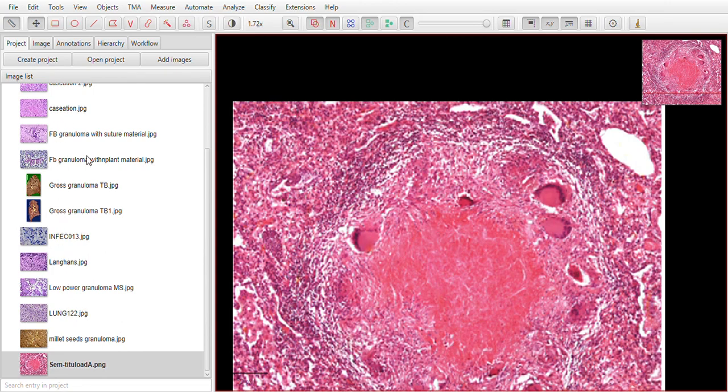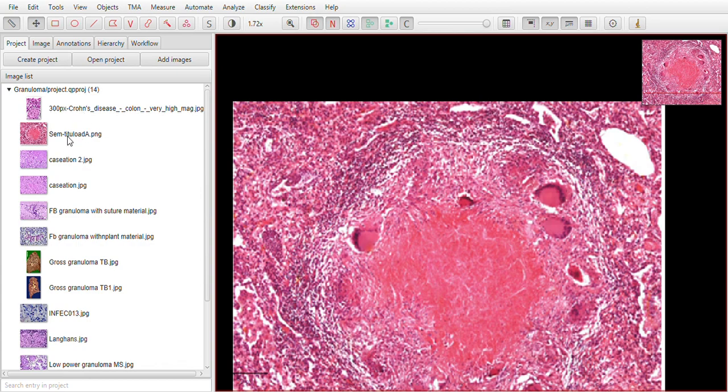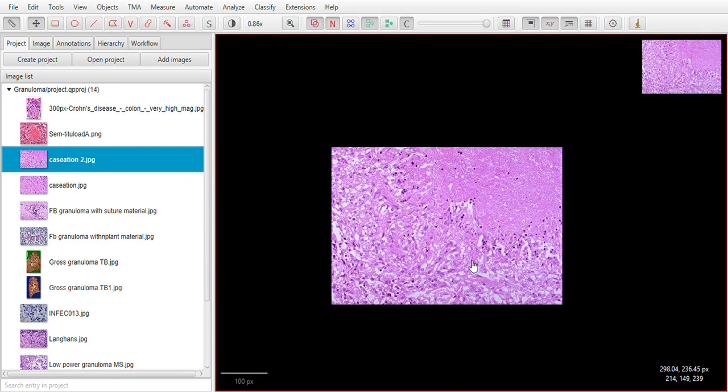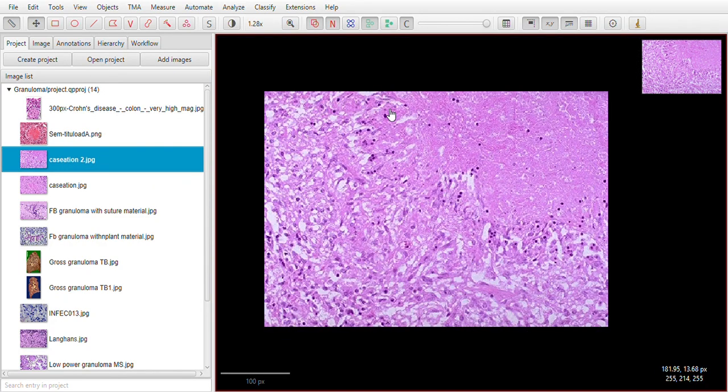For another tuberculous granuloma, I can show you this slide, which may give you a different view. This is again another granuloma which has caseation necrosis in the center, and some dashes of these purple dots which are elongated cells.